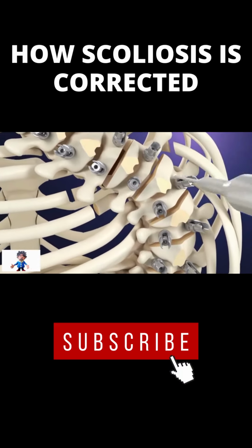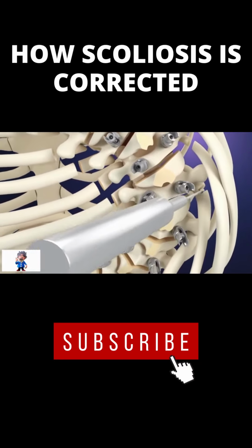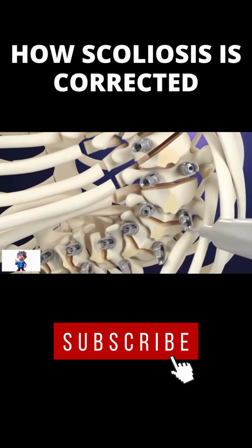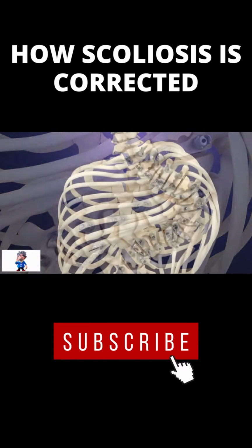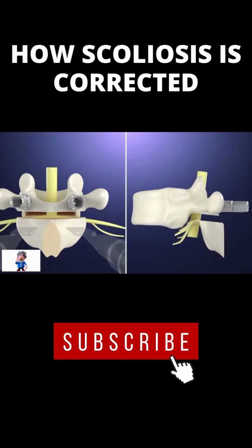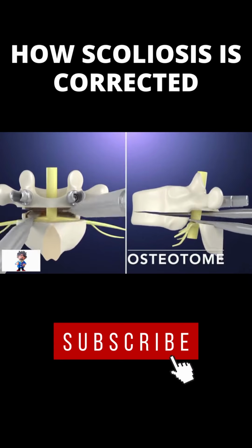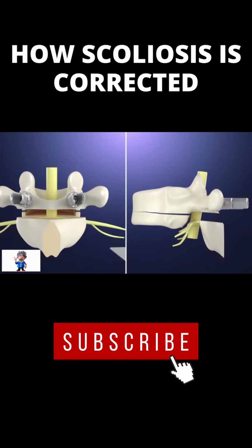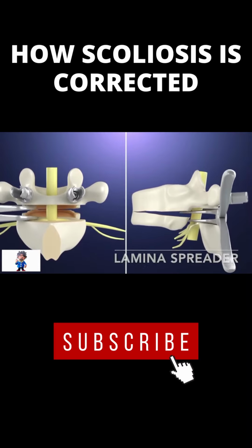These resections are repeated at multiple vertebral levels, depending on the severity of the scoliosis. After completing the various resections, the surgeon then cracks the vertebral cortex using a tool called an osteotome. The crack in the vertebral body is then widened using another surgical instrument, known as the laminar spreader.